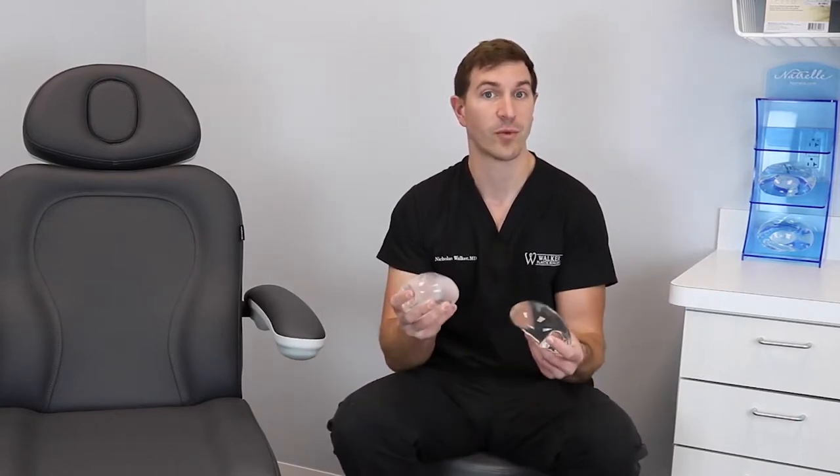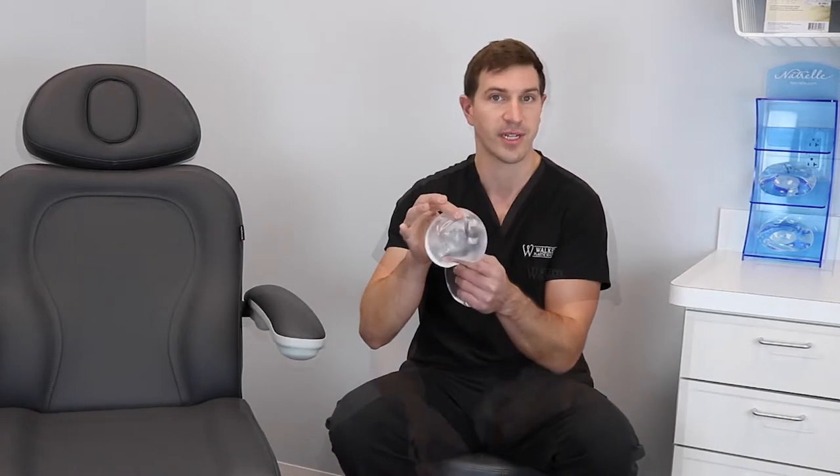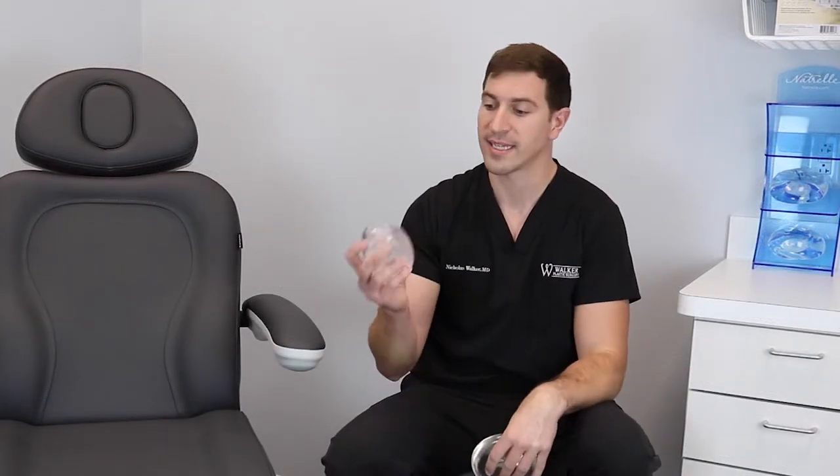What's inside of a breast implant makes a big difference on how it looks and feels inside your body, but it also makes a big difference on what happens if the implant has a rupture or a break in the silicone shell. A silicone implant is filled with medical grade silicone, while a saline implant is filled with salt water that's sterilely put inside the implant during your procedure.